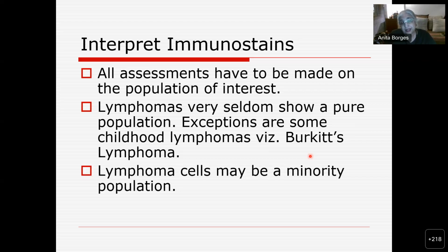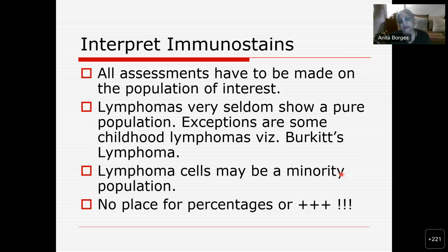Okay, T cell rich B cell lymphomas. What is it? The very word tells you that it is full of T cells. You have to really look for the cells of interest. They are usually larger than the other cells, but don't bet on it. You just need a little bit of experience. Fortunately, these are not very common occurrences. But I will just tell you that there is no place for percentages or plus.